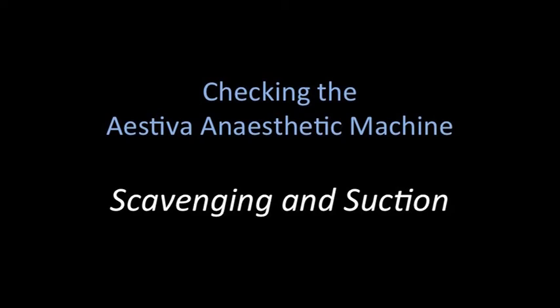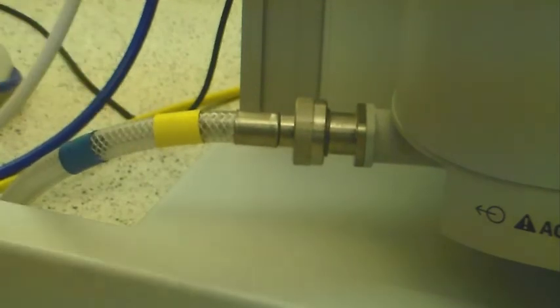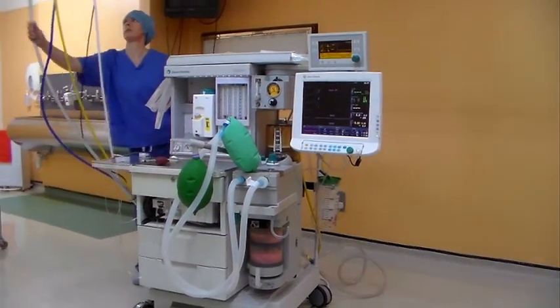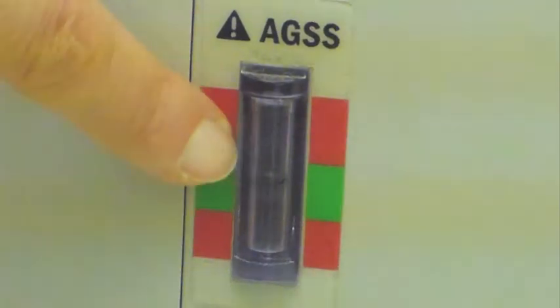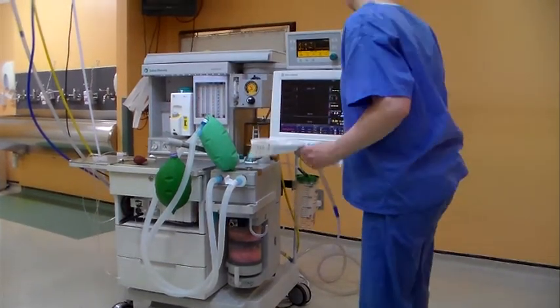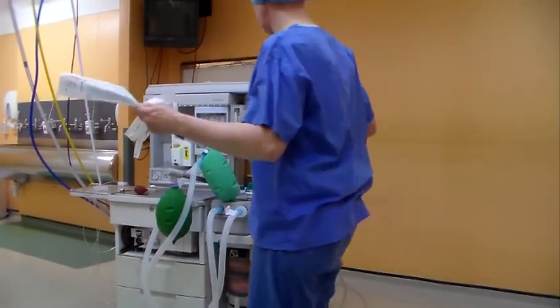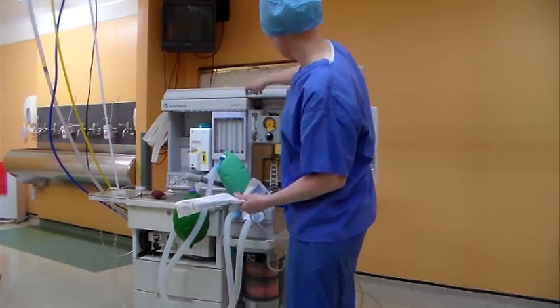Scavenging and suction. Check that the anaesthetic gas scavenging is switched on and functioning correctly, with the tubing attached to an appropriate exhaust port. Check that the suction apparatus is functioning and the connections are secure. Test that the suction is able to provide the rapid development of an adequate negative pressure.